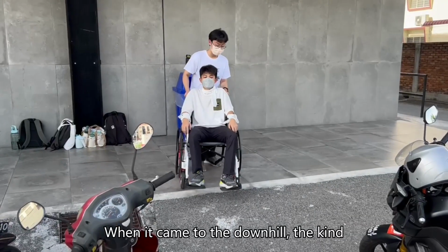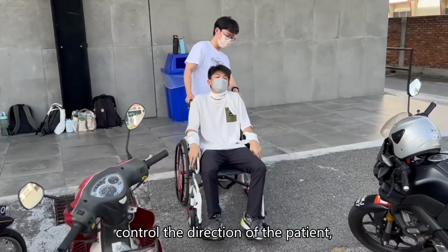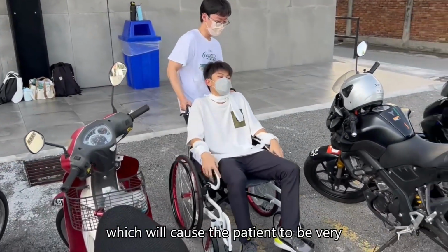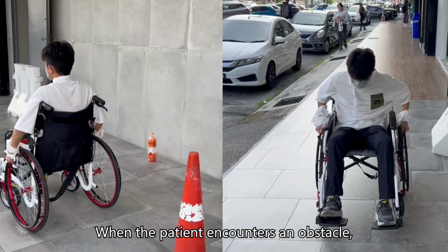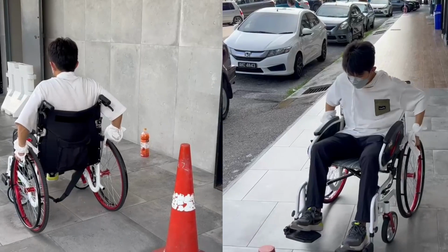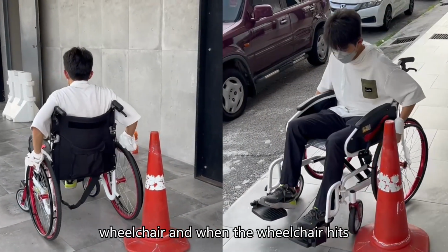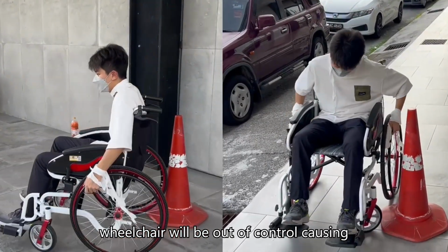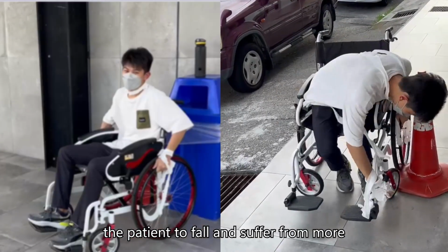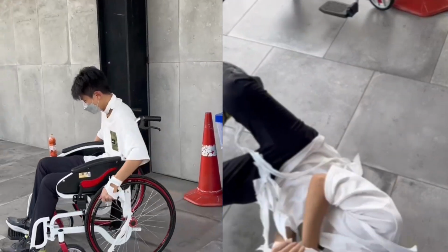When it comes to the downhill, the kind man was too weak, so he was unable to control the direction of the patient, which will cause the patient to be very scared and shaking. Obstacles. When the patient encounters an obstacle, the patient has difficulties in controlling the direction of the wheelchair, and when the wheelchair hits the obstacle, the direction of the wheelchair will be out of control, causing the patient to fall and suffer from more serious fractures due to the impact of the collision.